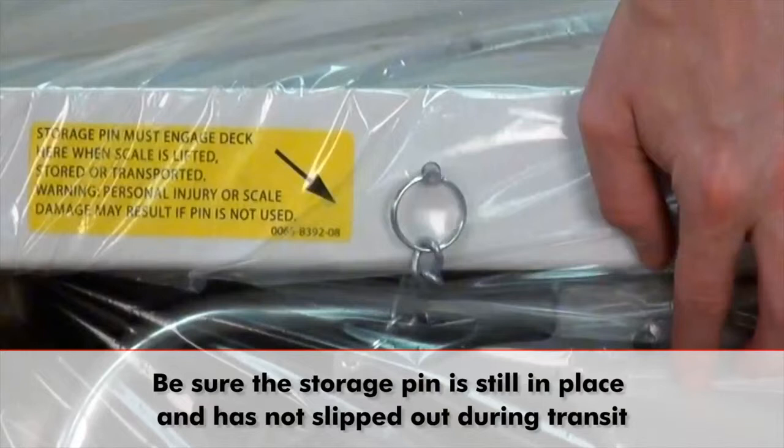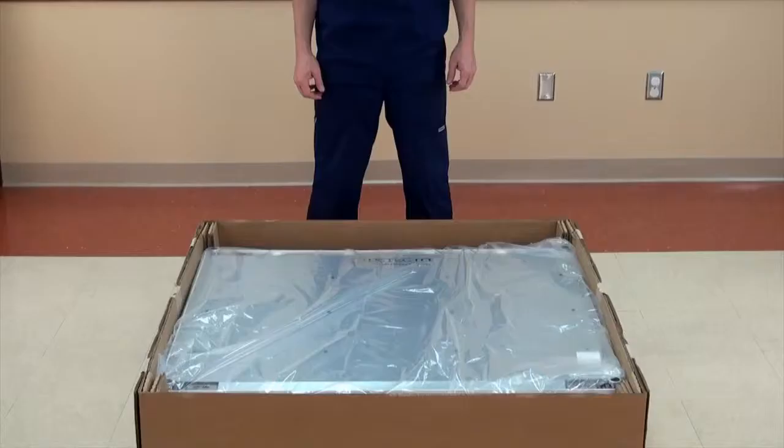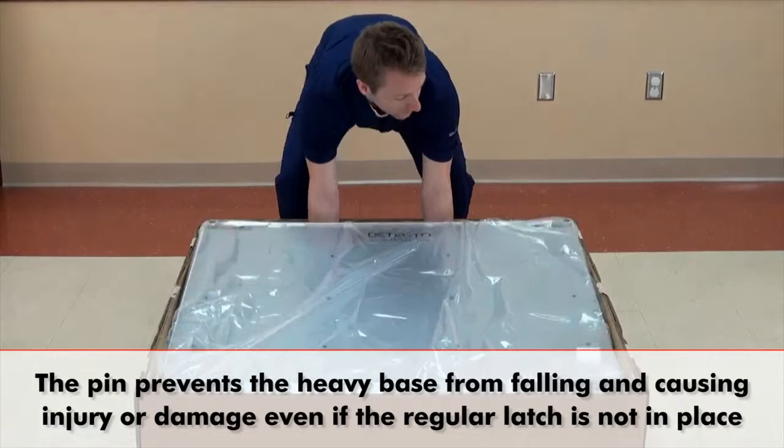One very important precaution at this point: be sure that the storage pin holding the column to the scale base is in place and has not slipped out during transit. If the pin has slipped out, replace it before lifting the scale.